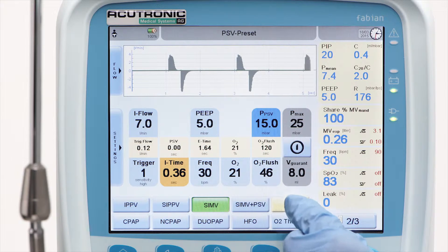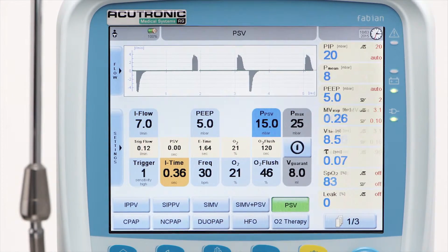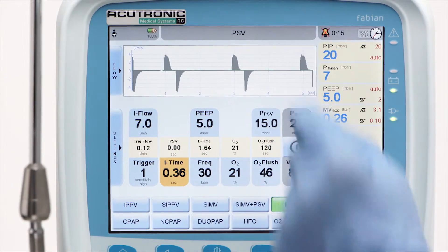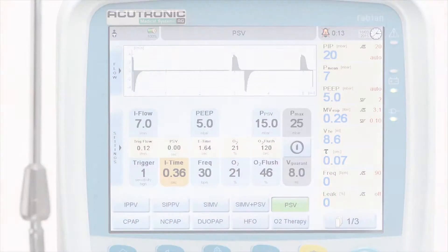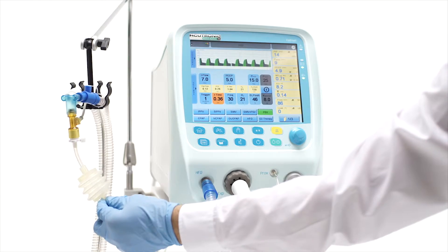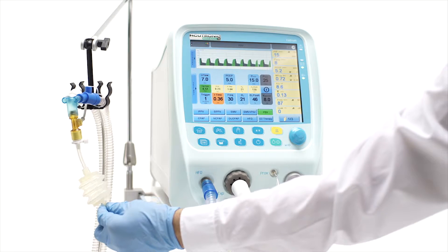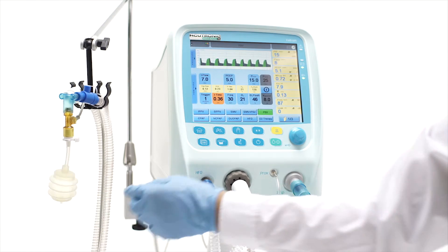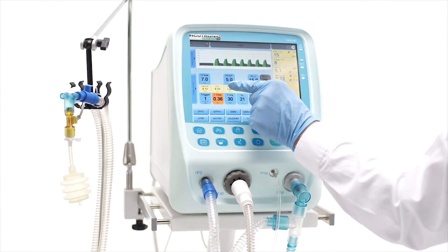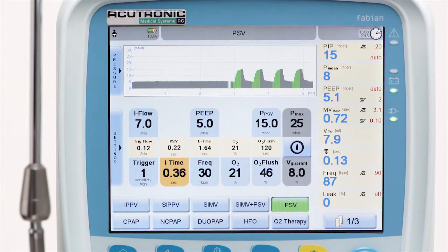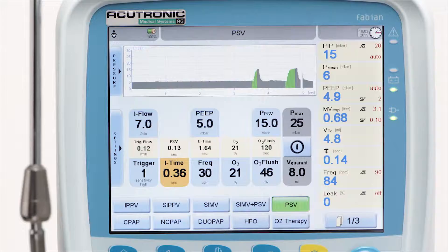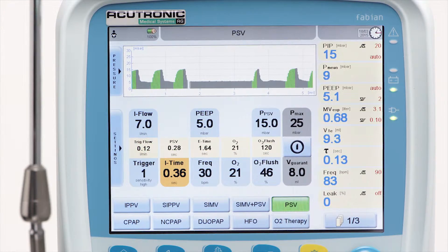That's why in PSV mode the i-time button changes its color to orange. The real patient's inspiratory time is not fixed, but controlled by the patient's breathing pattern. It can vary breath by breath and is measured and displayed in the yellow numeric window above the i-time button.